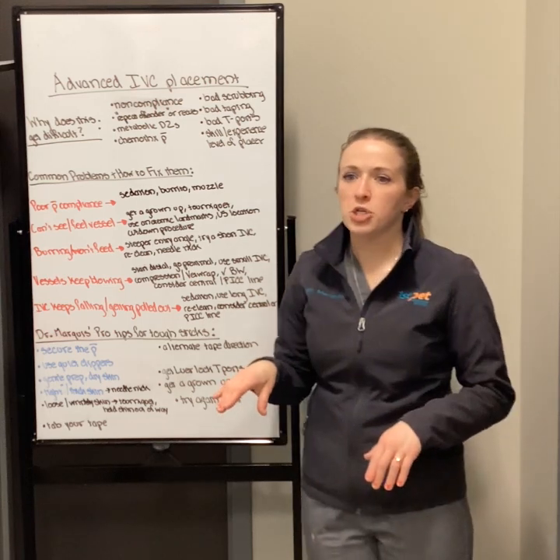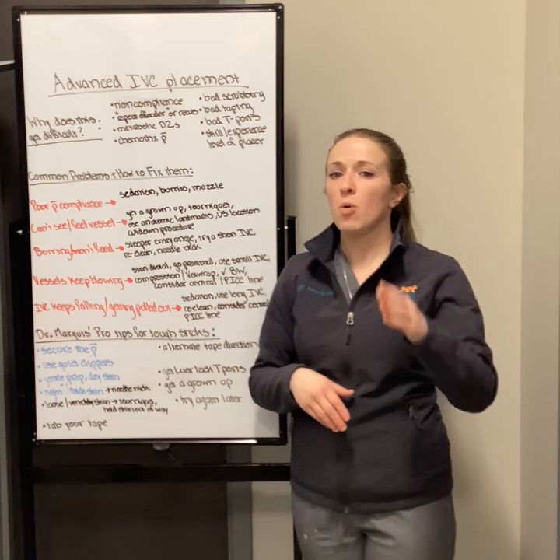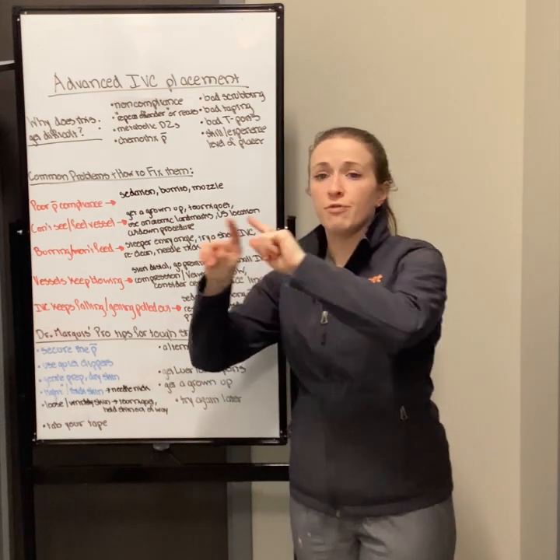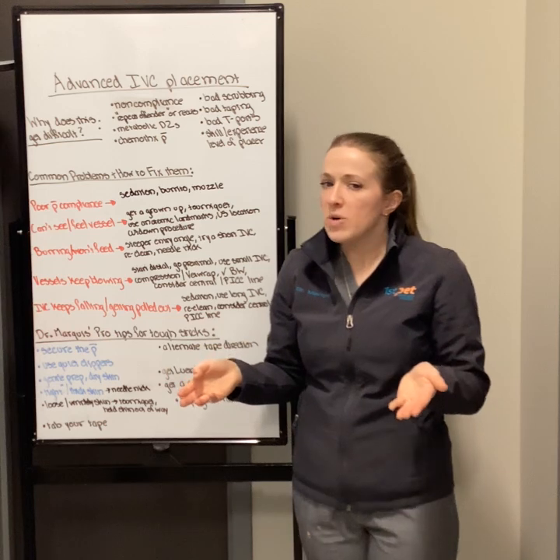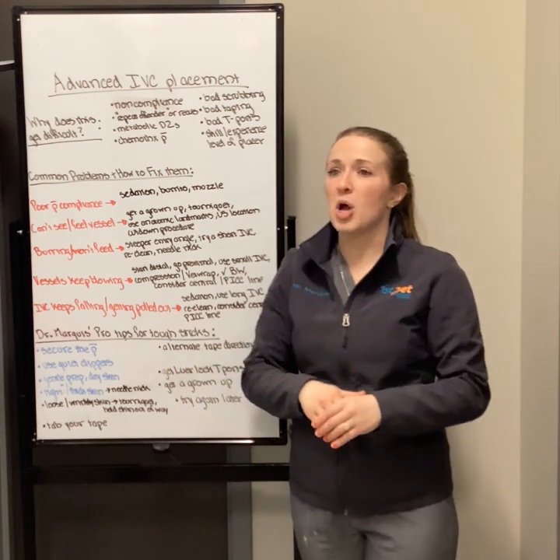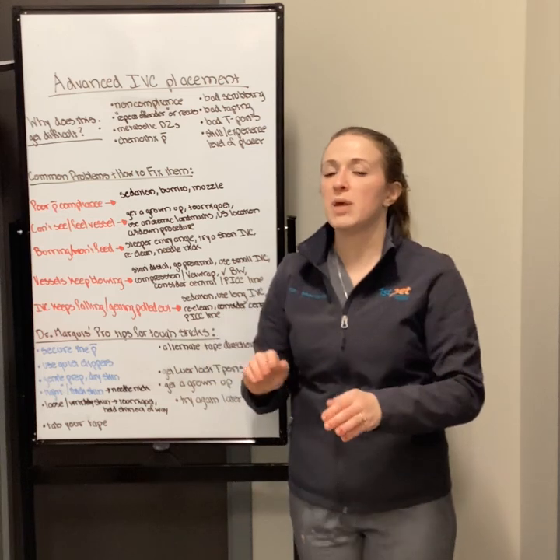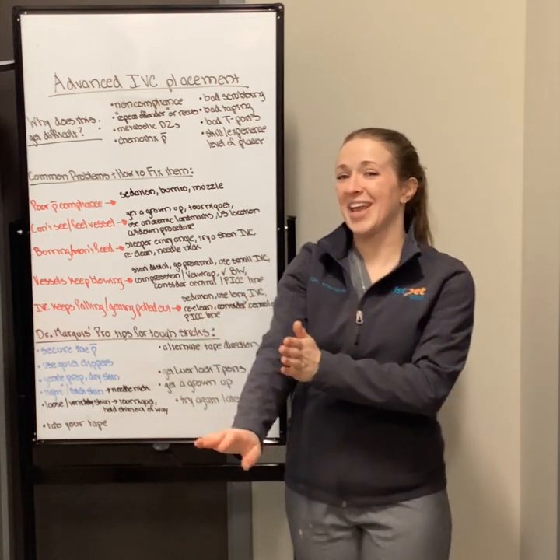Alternating the taping direction. The reason I think this is important is that if you have one piece of tape going left and one piece of tape going right, the net pull is in the center. If both pieces of tape are getting flipped to the left of the leg, the net pull is to the left. This isn't always a problem, but certainly in some dogs that have angular limbs or in dogs that are in hospital for days, what can end up happening is that the catheter gets distorted, it gets pulled, and then it becomes what we call positional. So the animal has to straighten its leg or you have to straighten the catheter in order for it to work.